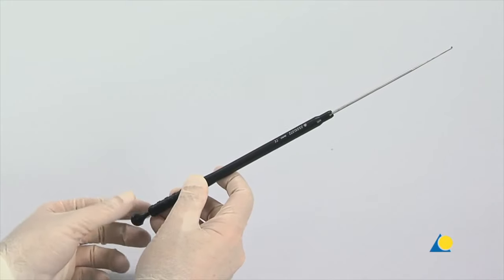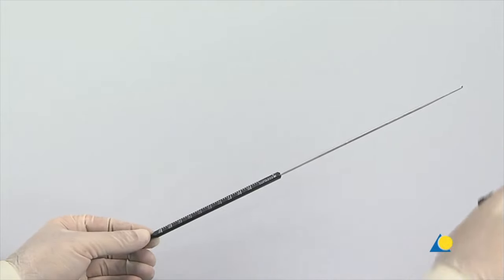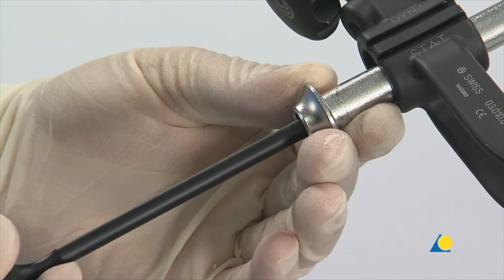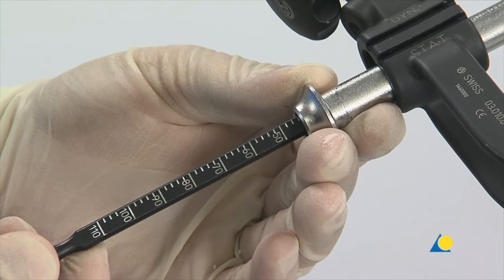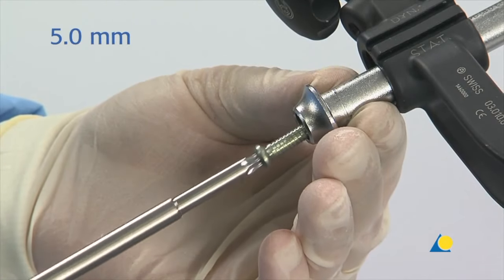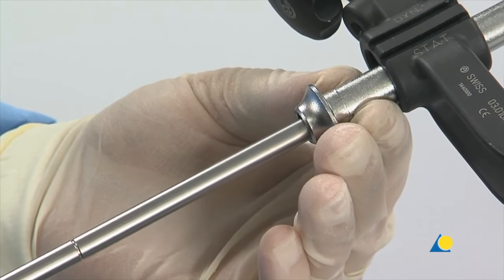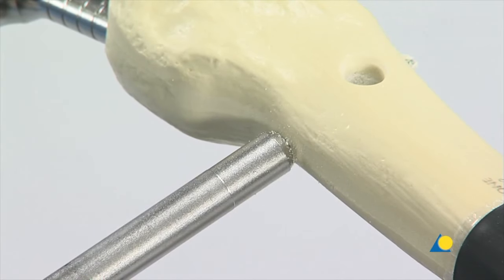The screw length can also be determined with the depth gauge. To do this, the sleeve must be removed. The depth gauge is inserted through the protection sleeve and the screw length is read off the scale. The appropriate 5mm locking screw is inserted through the protection sleeve with the star drive screwdriver. The tip of the locking screw should not project more than 2mm beyond the far cortex. The position of the locking screw is verified with the image intensifier.